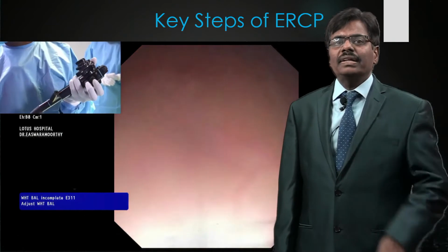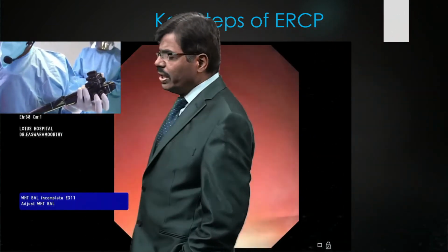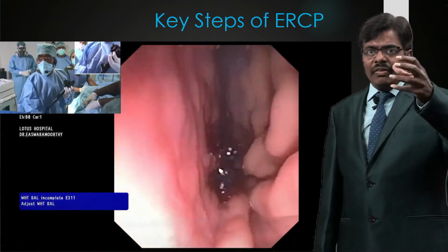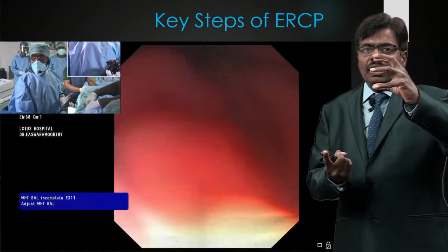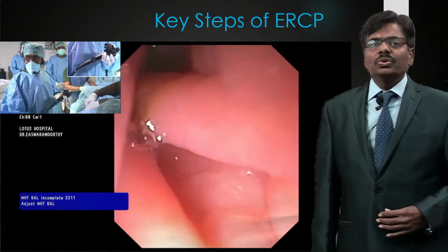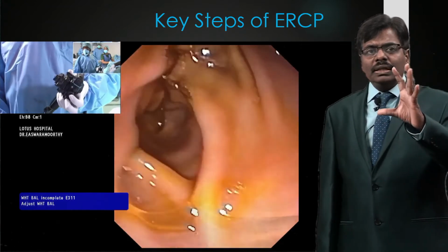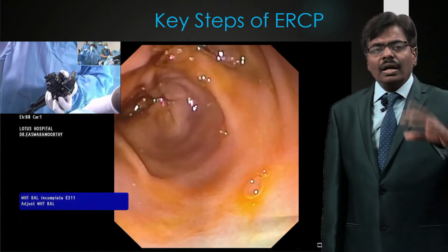I am getting inside the esophagus. Now we are in the esophagus. Unlike an end-viewing scope, you can see the view is not very great, but with the big wheel away from you. Okay, big wheel towards you will take it this way, but you want it to go the other way. So you want to take the big wheel away from you. That way you will be able to see the lumen, and as you go along the greater curvature, what we call the long route, you can see the bile and the antrum, and we are nearly going and saying hello to the pylorus.